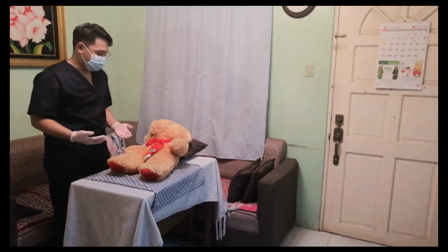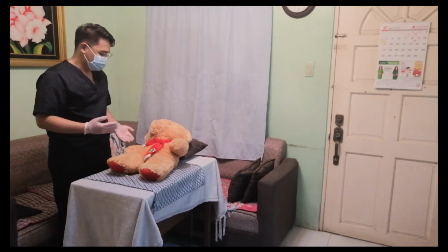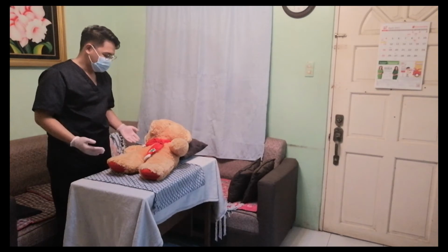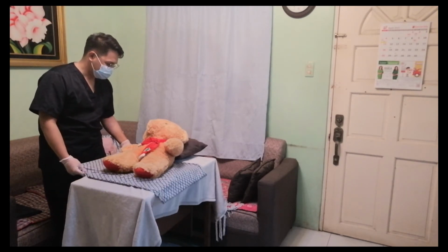For our seventh step, we need to use that friction reducing sheet to move the patient to the edge of the bed, opposite to the side towards which he or she will be turned. Okay. So ma'am, i-move ko lang po kayo sa edge ng bed dito po sa aking side. So, magka-count po ko ng 1, 2, 3. Okay po. 1, 2, 3.